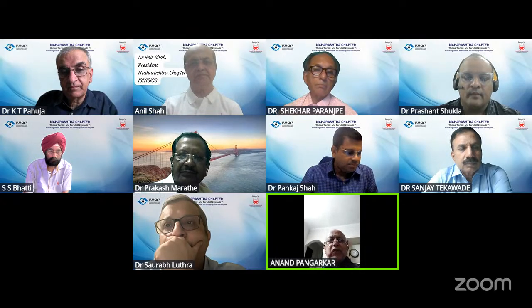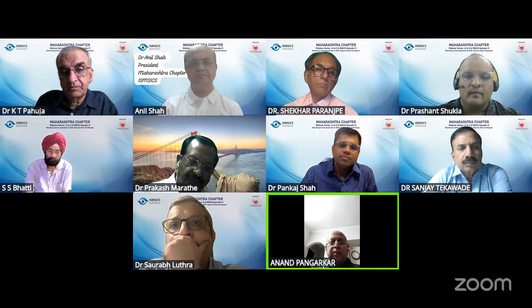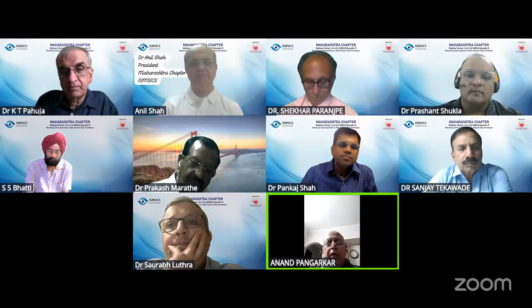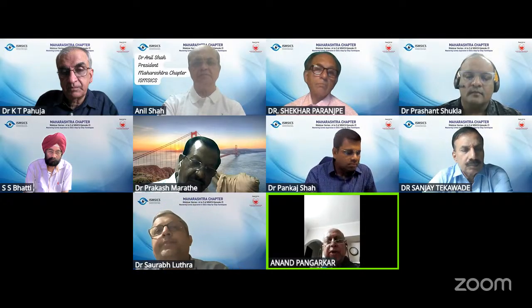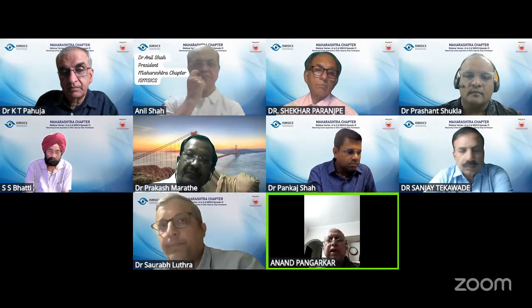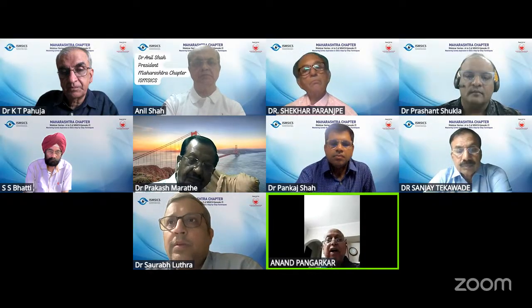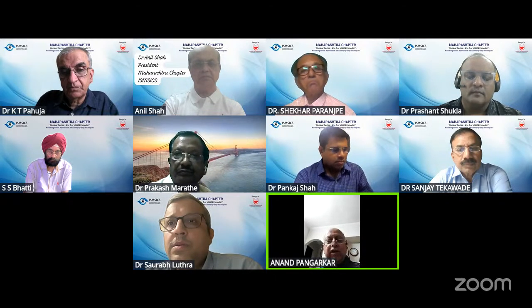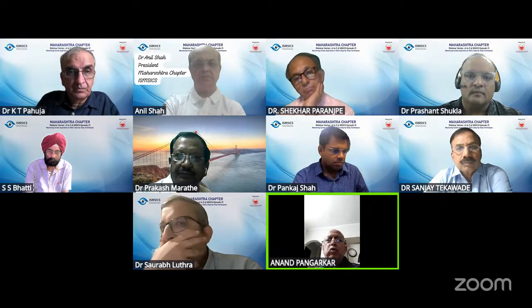Presentations short, to the point, excellent videos, and great teaching. I thought I will add a few things. Between a Simcoe and the other technique, which uses the irrigation and aspiration ports in very close proximity, which is the cause for the cortex running away from you when you try to aspirate. That whole thing is solved by the use of an AC maintainer.